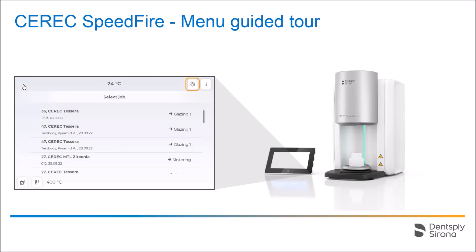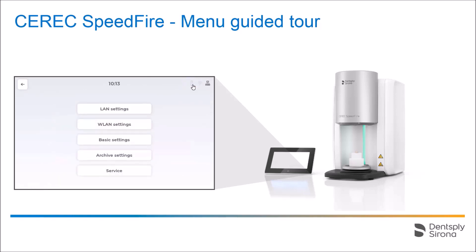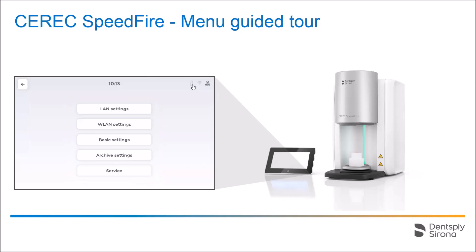Now we switch to the settings menu. This area includes sub-menus about the network settings, service features, and more. We will take a detailed look at each of them.